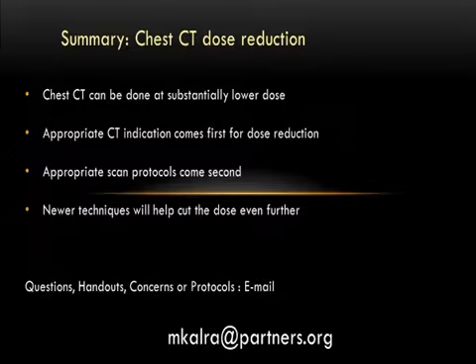The use of lower kV has been reported from before the iterative reconstruction era and for several years. And there is quite a lot of experience that we have collected using lower kV for the past several years. Certainly if you look at the pulmonary embolism literature, that has been coming since the early 2000s, before any noise reduction filter or IR techniques were there. So we personally have not noticed any change. In fact, one of the things our radiologists tell us is that when you have contrast on board and you use lower kV, the contrast in the images they get is consistently so nice that they just wonder why the other patients are not small, so as to enable us to use the lower kV.